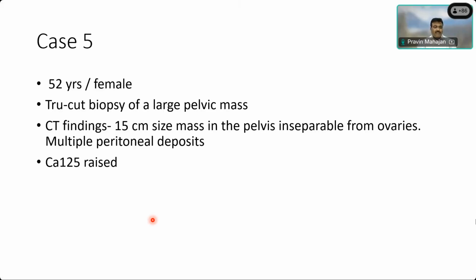A 52-year-old female, a true cut biopsy of large pelvic mass. The moment we say pelvic mass, you should think, if it is female, it is an ovarian tumor, right? So that's how we think. Or maybe from the uterus, but most likely ovarian.